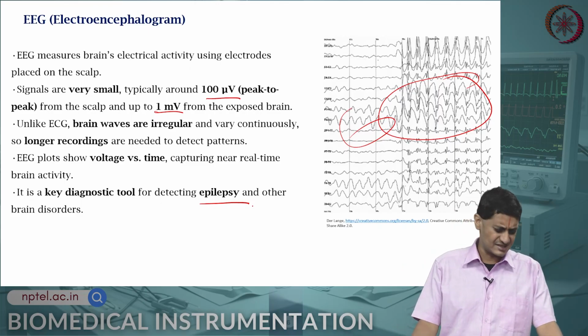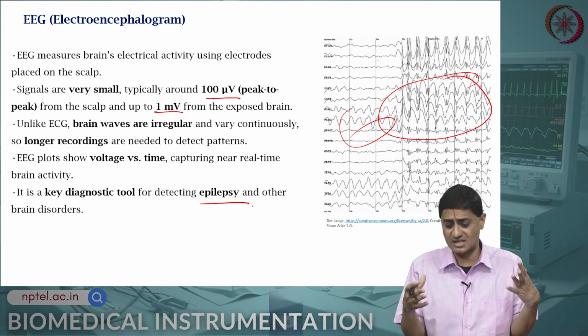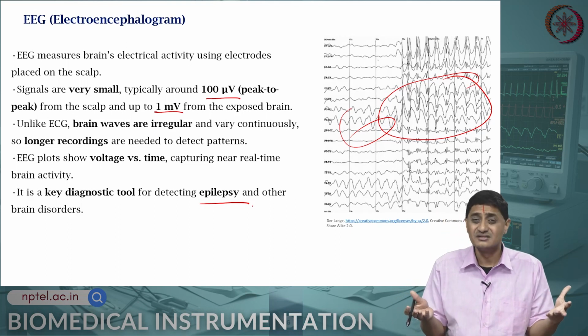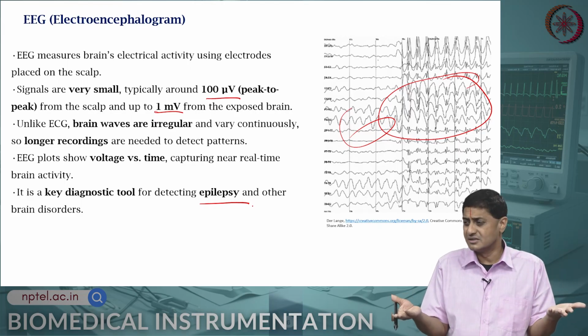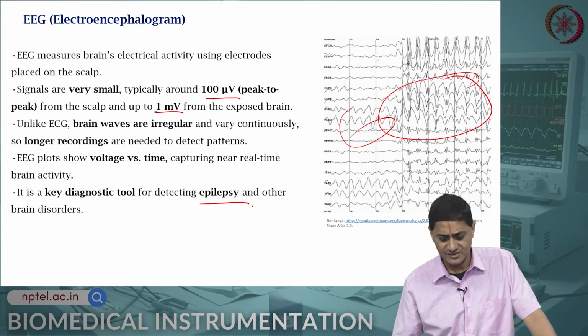There are other fields like sleep studies, alertness studies, cognitive studies, studying EEG to assess mental health, cognitive health, to assess depth of anesthesia, so many other ways in which you could study, and sleep health, sleep hygiene for example, all those things can be studied using EEG.